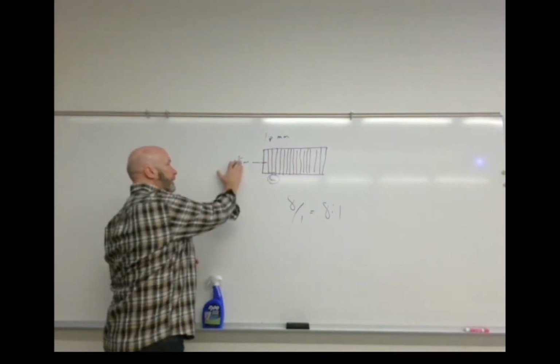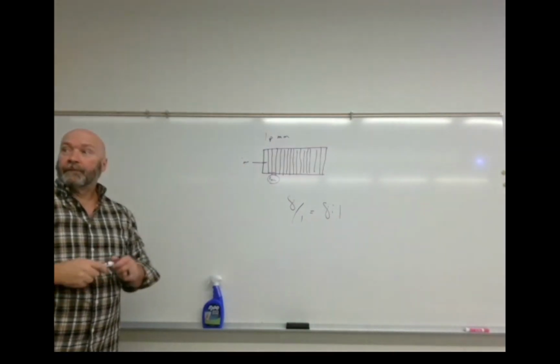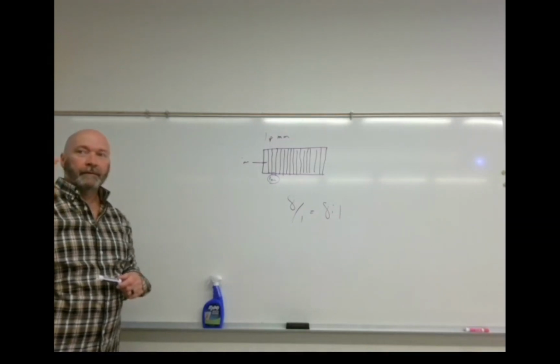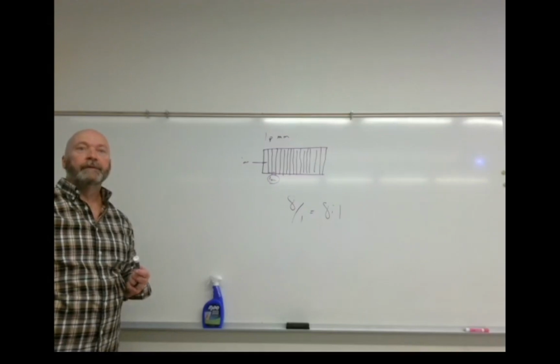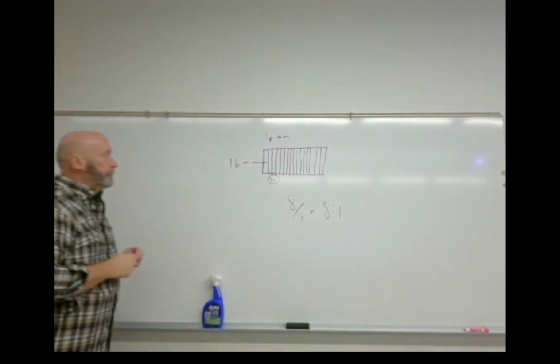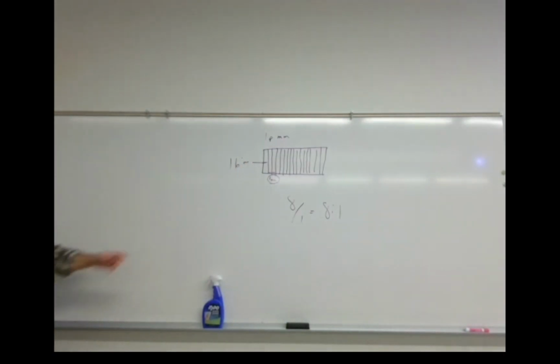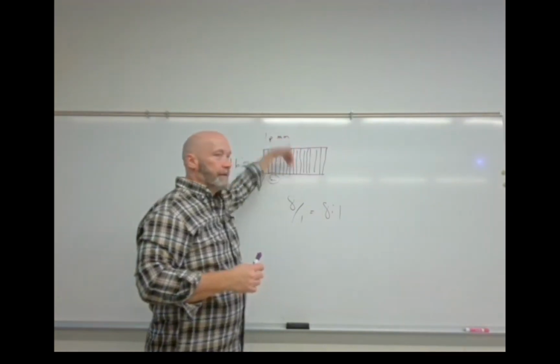What would my grid ratio now be? If it was 8 to 1 before, times 2, we doubled the number of grid strips. 16 to 1, right, 16 to 1. So again, what we've got is thinner hallways, so to speak, so that the scatter radiation has a harder time getting through.